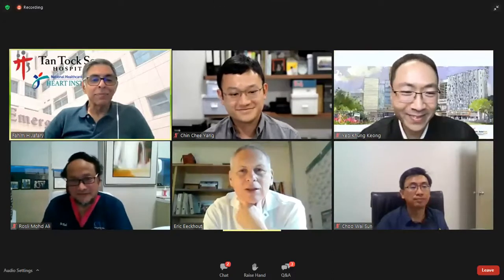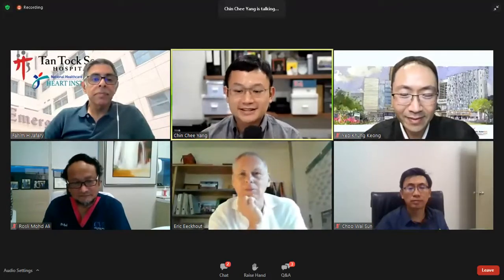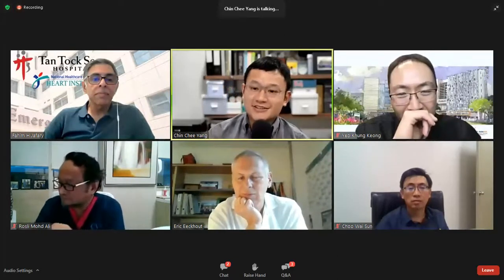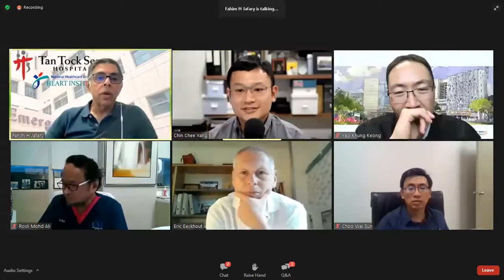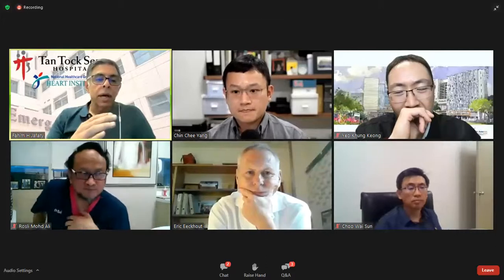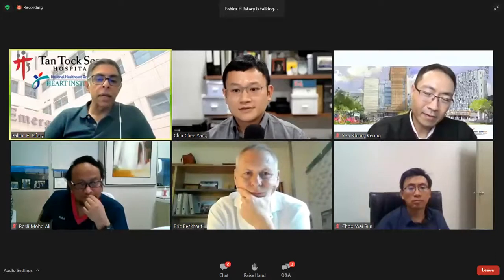Thank you. Any comment from you? You need to unmute. Yeah. No, I think I agree. It's a great case. I was just trying to understand, maybe because I guess I showed a similar one. When you stented the circ, right? You stented the left main into the circ. Sorry, this is for the left main bifurcation. You stented the left main to the circ, and then you crushed. No. I did a DK crush, so I stented the circumflex, with a little protrusion into the left main, then crushed it, and then stented the left main into the LAD.